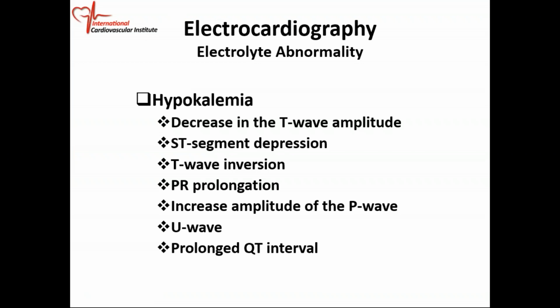These patients can go into torsades de pointes, that's a ventricular tachycardia, and they can die from ventricular fibrillation, okay? So with a low potassium, hypokalemia, opposite to what you would get with hyperkalemia, you get a decrease in the T wave amplitude. So instead of the T wave becoming peaked, it becomes very small.